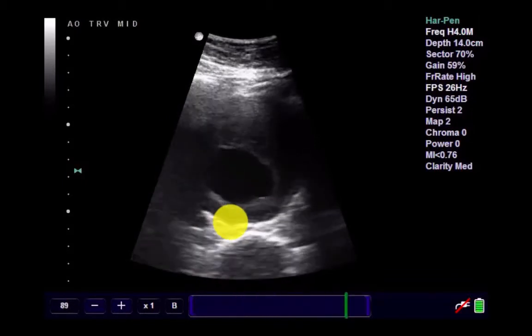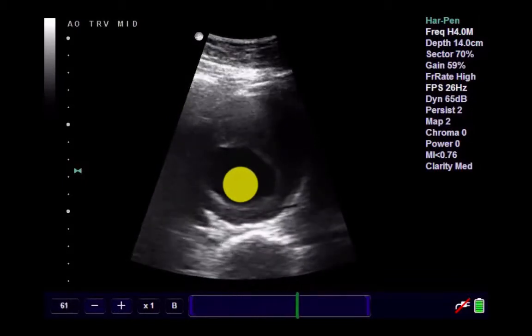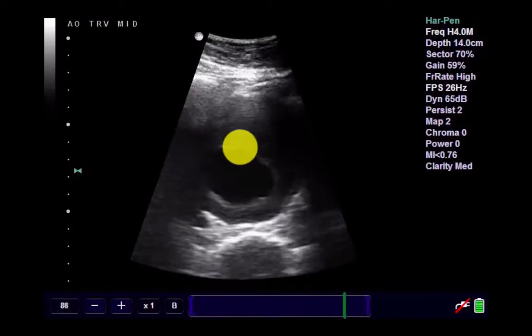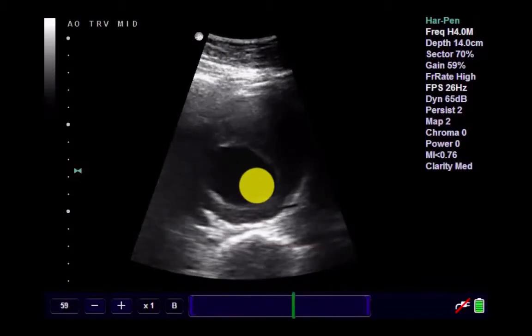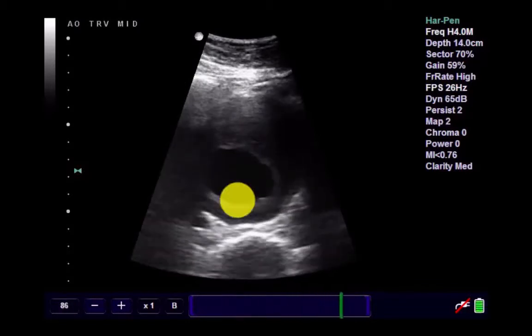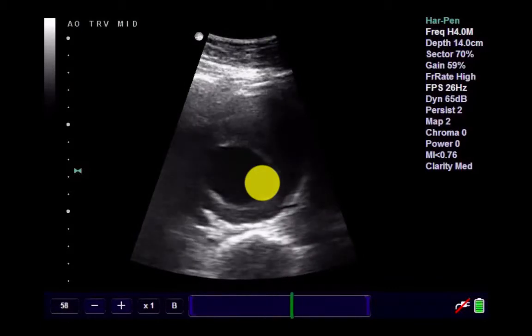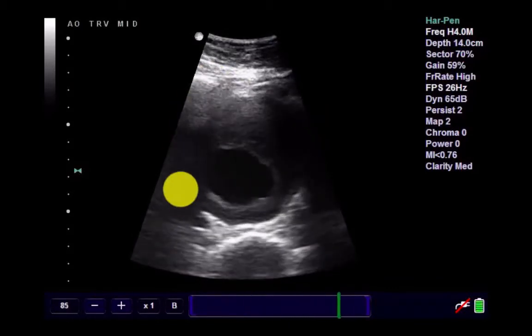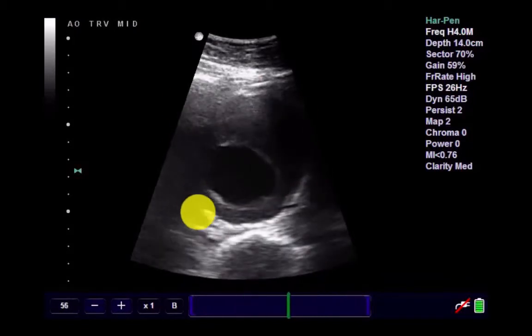Okay. One of the pitfalls, and we'll talk about this briefly later on, is people that look at this and measure that and say, it's okay. Now, this is still pretty big. And hopefully, if you measure this, it would still be above 3, but it does not measure nearly as big as this kind of entire aneurysm sac does.